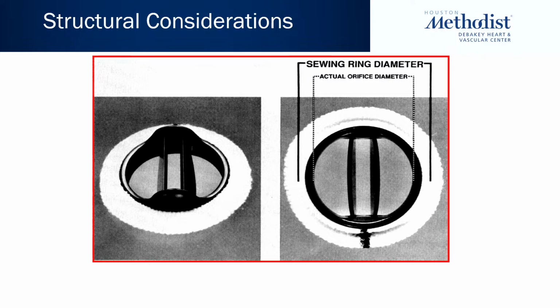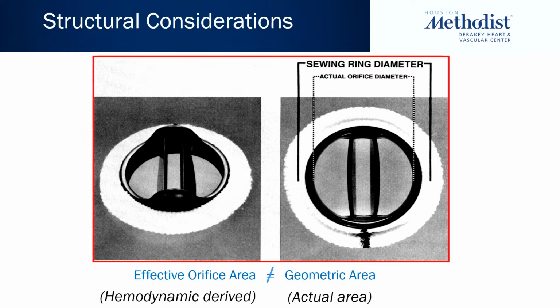You need to know, at least for a particular St. Jude valve, particularly in the mitral position, that 31 and 33 millimeter valves are exactly the same, and what the difference is, is that the sewing ring is much larger to be able to sew into a much larger annulus. So the hemodynamics are the same. You may see rocking of the valve in a 33 because of the largest sewing ring, and that may not necessarily mean that it is a dysfunctional valve.